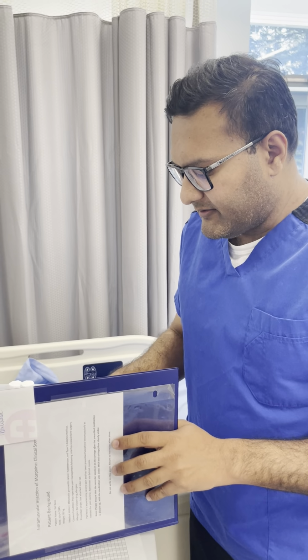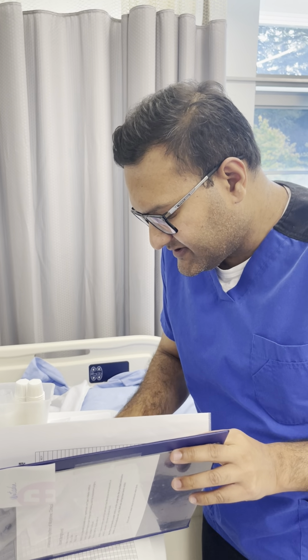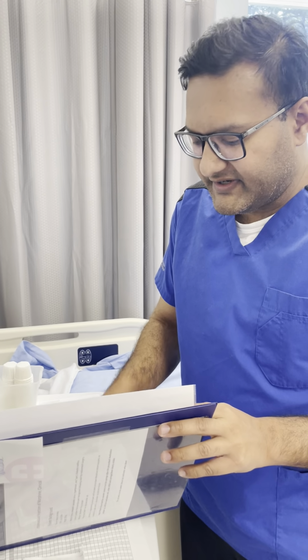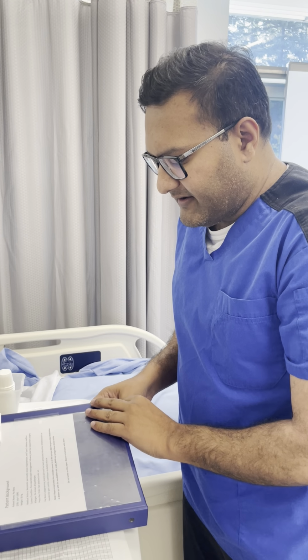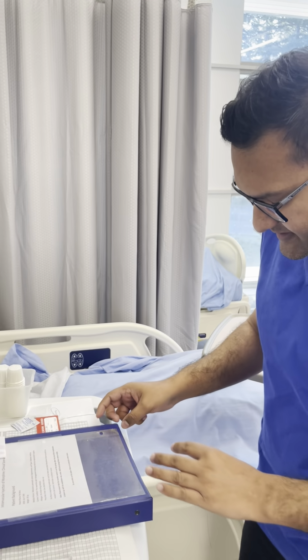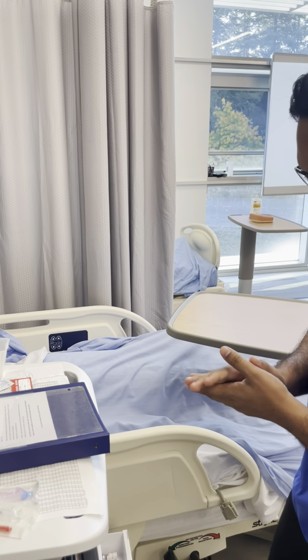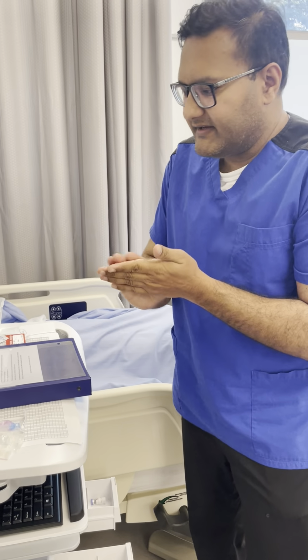I will compare the prescriber's order with the medication administration record and do see morphine 6 milligram intramuscular Q4H-PRN. From here, I have done my dosing calculation. Before I begin, I am going to prepare the asepsis by performing hand hygiene.